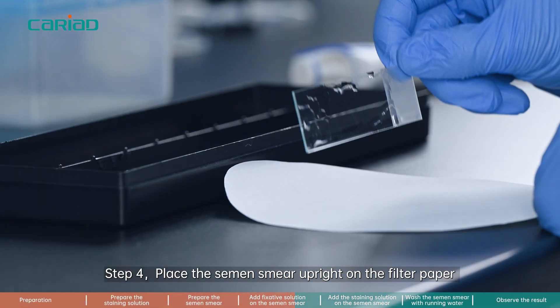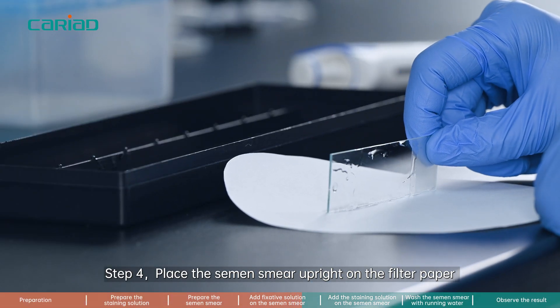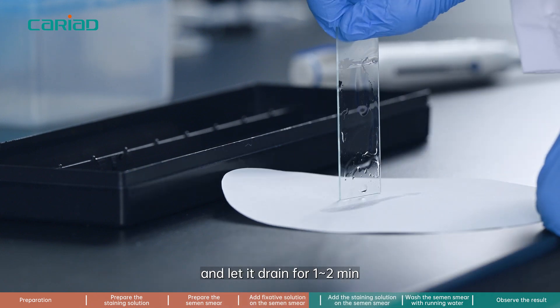Step 4. Place the semen smear upright on the filter paper and let it drain for 1 to 2 minutes.